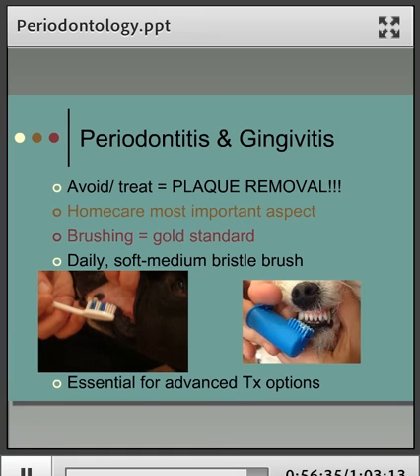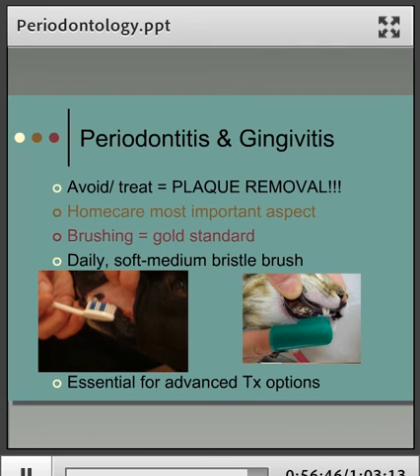Or here again, you can see how this is virtually the same size as the cat's mouth or even head in this picture. So not going to be effective. And again, it will clean the tooth surface, but it cannot get below the gum line. So not useful, I'm afraid.